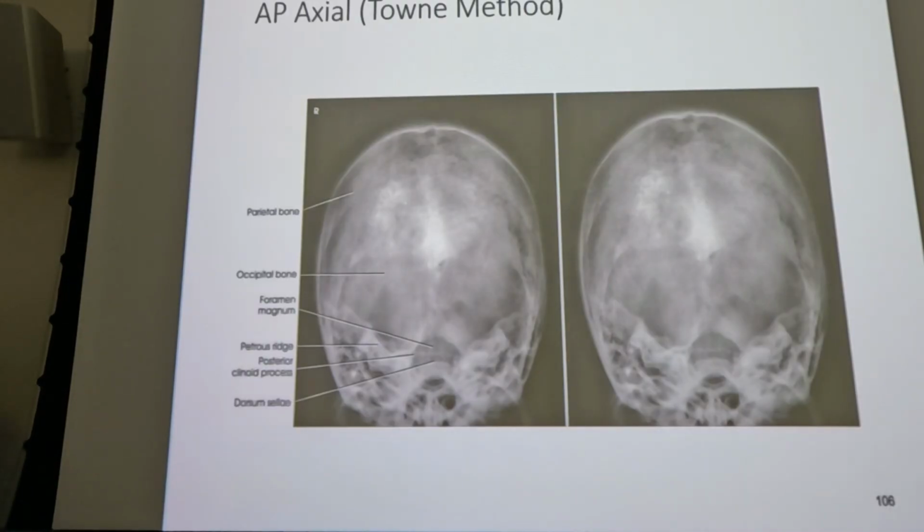So there's a couple of different angulations to see a more complete image of the foramen magnum. I think you can increase your angulation to as much as 50 degrees. Your machine probably won't shoot that. You get to a certain degree of angulation and your machine thinks you're trying to shoot tabletop, so it probably won't shoot that. You'd have to set a technique in order to make that happen. But if you want to see more of the foramen magnum, you just increase angulation more.